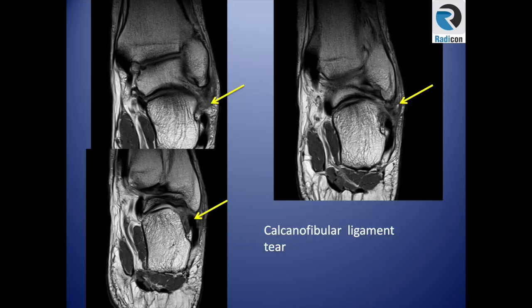For the calcaneofibular ligament, loss of the normal low signal intensity within the ligament with thickening indicates a tear. Here you can see the course of the calcaneofibular ligament extending deep to the peroneal tendon; it is thickened and edematous with no identifiable fibers — indicating an injured ligament.